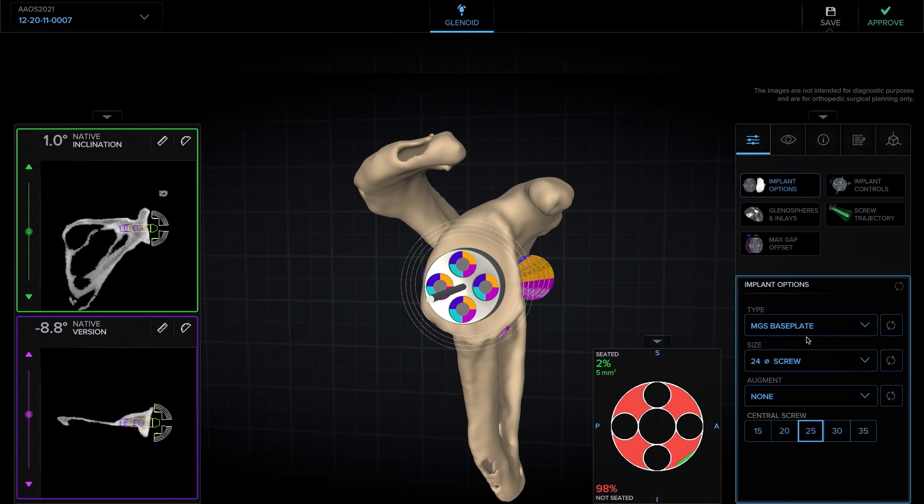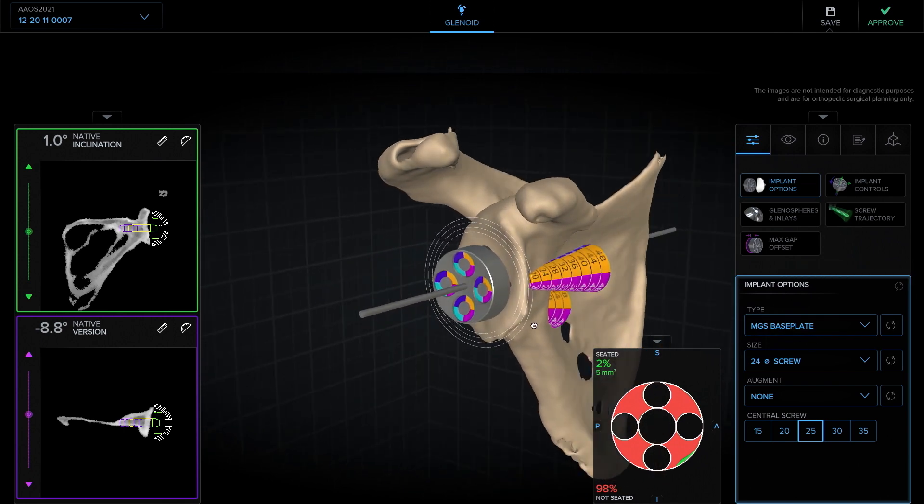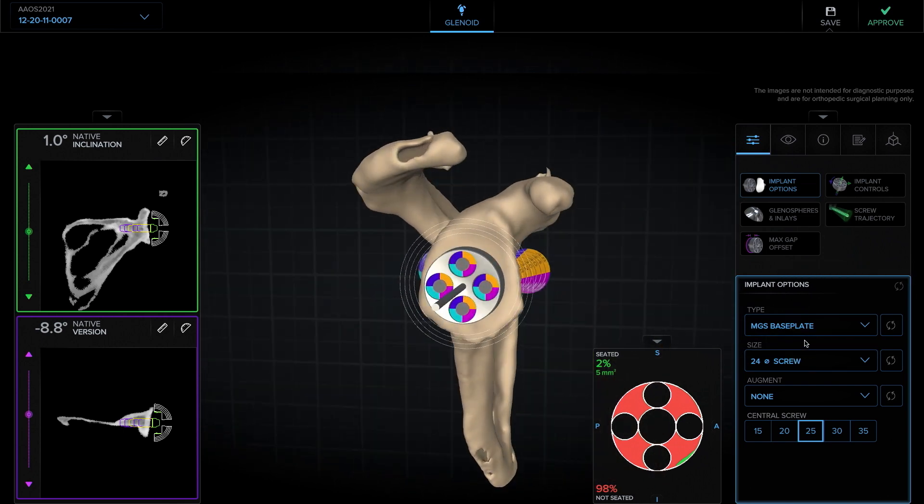That'll help me decide what implant I'm going to use. For this patient, I think it's very reasonable to use a standard MGS base plate. I typically will use a 24mm base plate and prefer a screw when I use a standard MGS.